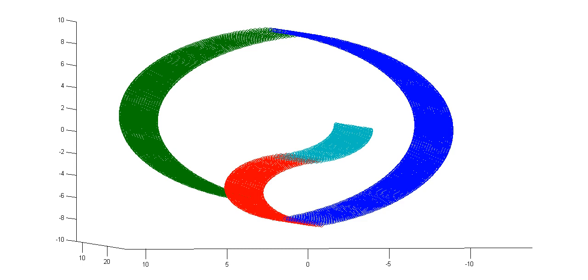Yeah, I think a good design is considered one where you do a first pass of the whole brain and look for what would be called regions of interest that seem like they're involved in the task you've been testing. And then, importantly, in a separate group of people, in data you've collected separately, you look at that region of interest more specifically. Then you can test the hypothesis that you generated from your full brain scan.